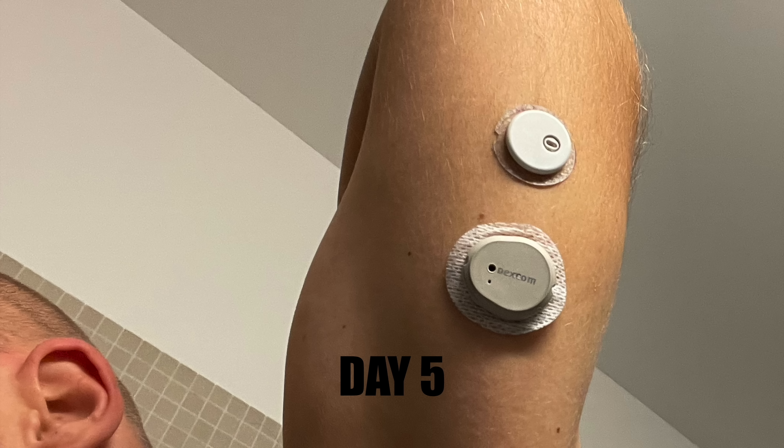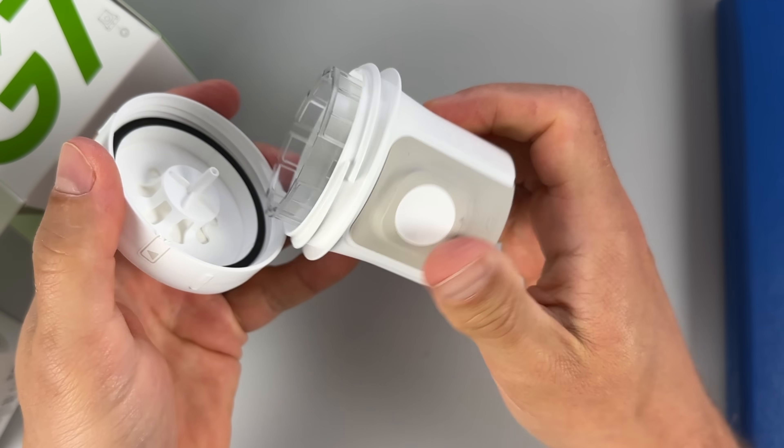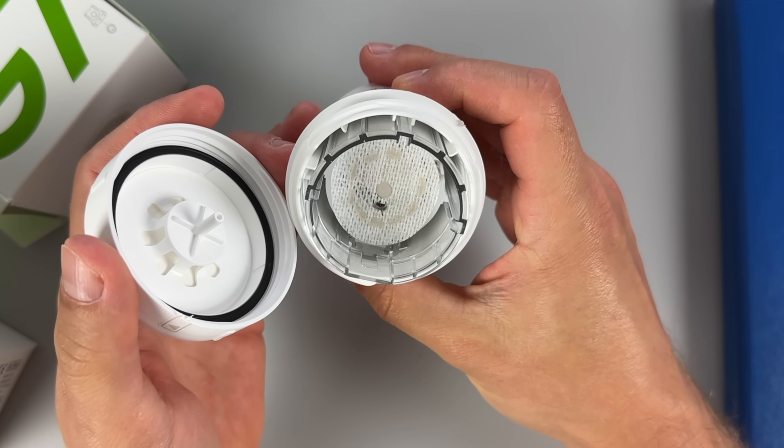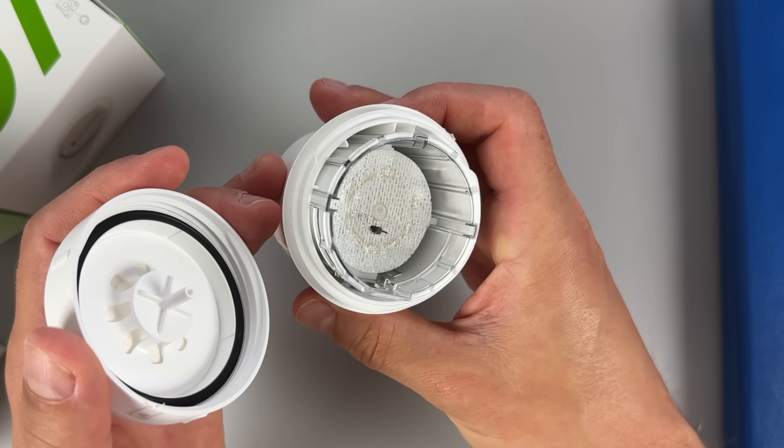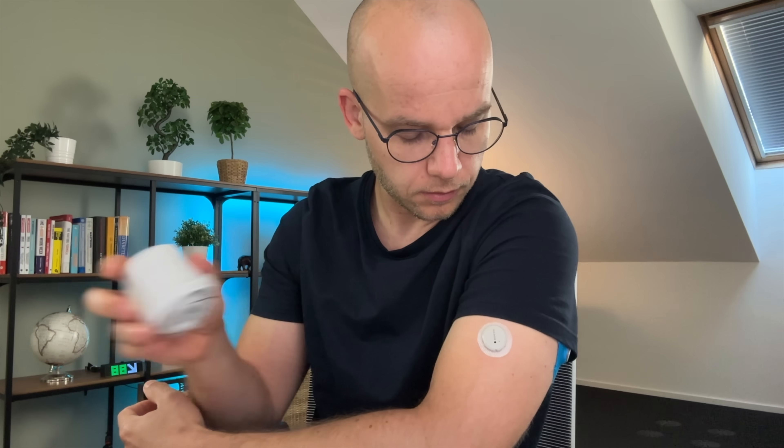When it comes to adhesives, it's not so easy to find a balance between something that is sticky enough and something that will be sensitive to everyone's skin, not causing any skin irritations or allergic reactions. But I have good news for you. According to the CEO Kevin Sayer, Dexcom has tested plenty of adhesive solutions and they were finally able to come up with a new one that's stickier but not too aggressive.